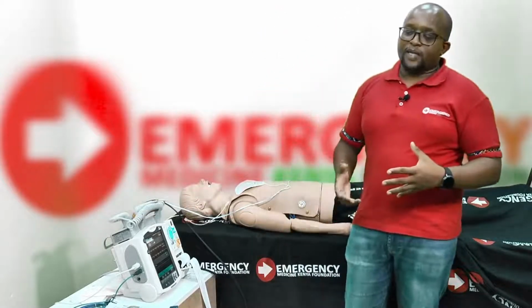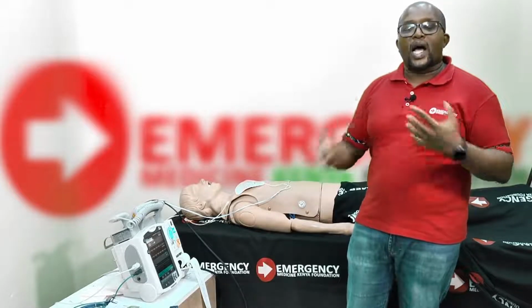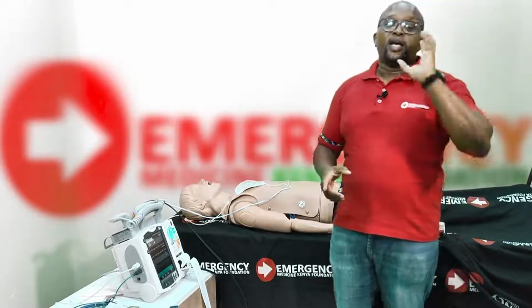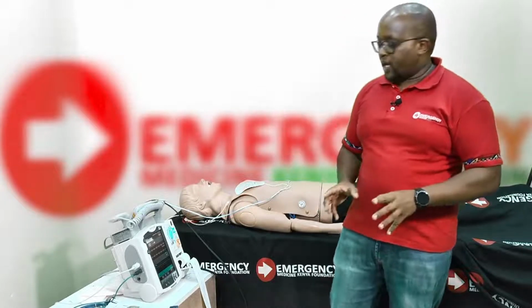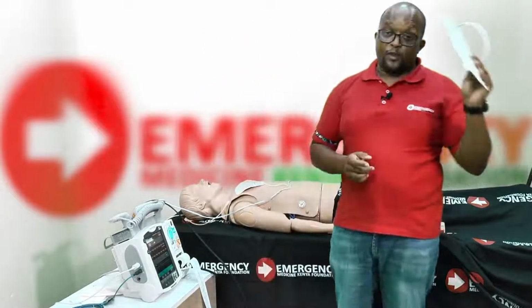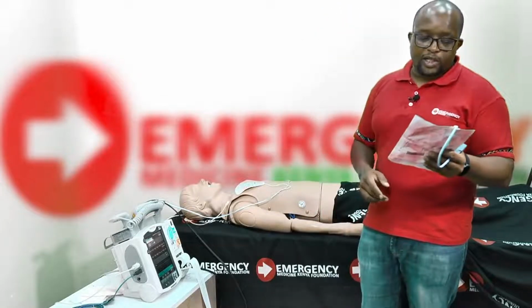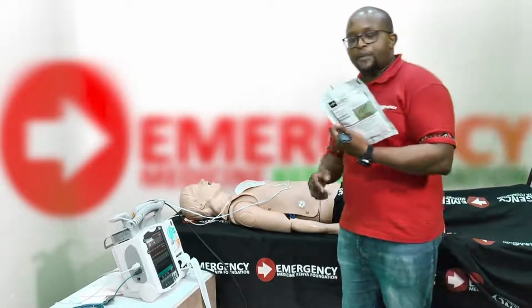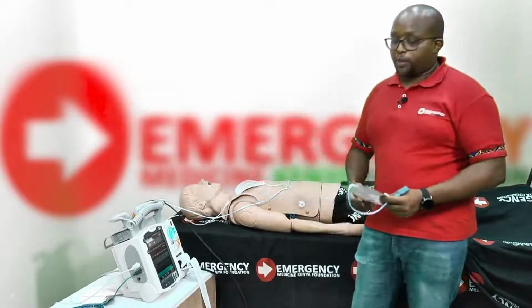The key thing is to hand over, what we call handover pacing. As I explained, download the Casualty app, get the algorithms. This procedure is well explained in there. But the key thing is you want to get your other set of pads, okay? So you cannot disconnect this patient yet. You want to get your other set of pads, and you can attach them. There are multiple options. You can attach them anterior posteriorly on your patient.